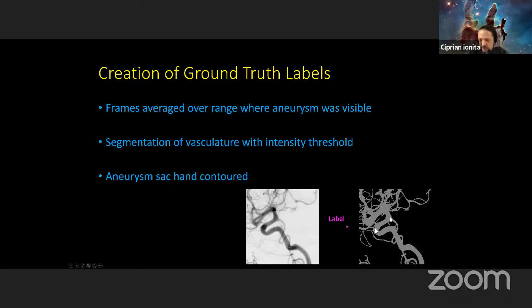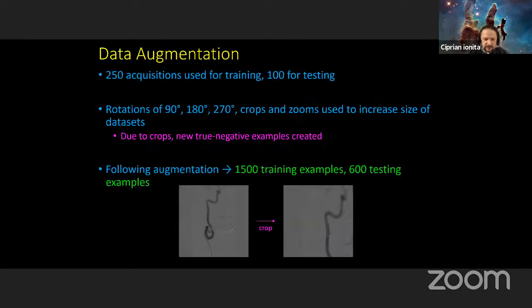We can have an automatic feature that can segment all the arteries, but for the lesion itself, it is very good if you have somebody hand contour it to make sure the data is right, and it had better be an expert in the area.